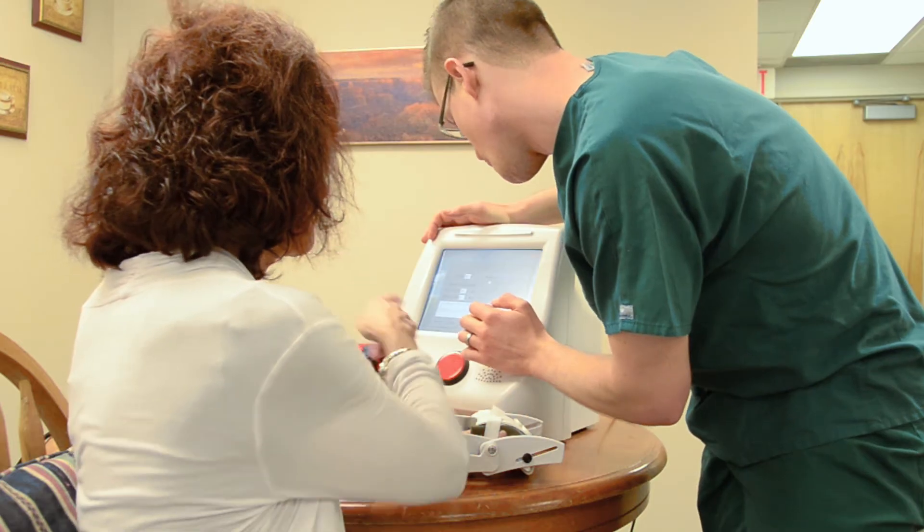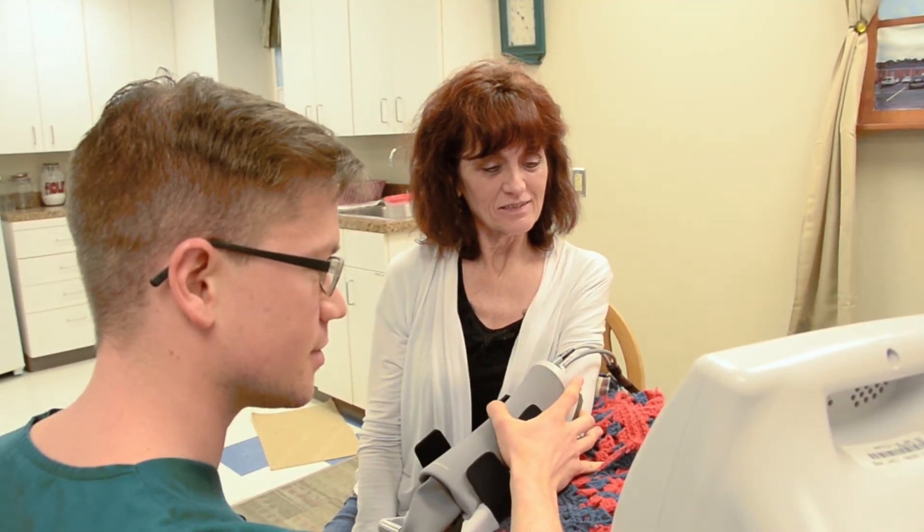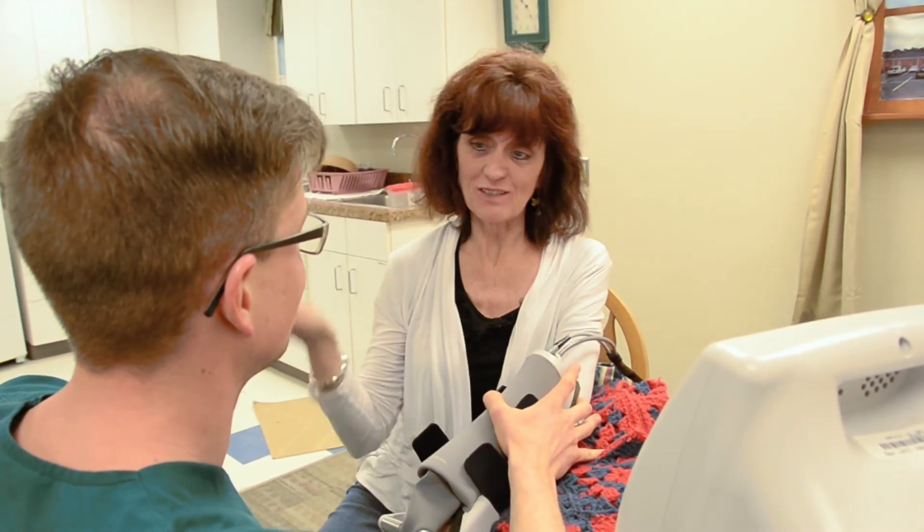One of the benefits of the HandMentor is that it is very easy to use. It's originally designed to be used without assistance, and so we find that our stroke survivors are often able to use this independently. The device was designed such that there was no complicated donning and doffing process, and the user interface is really quite user-friendly. It's a touch screen — you don't have to be really computer savvy to operate it.